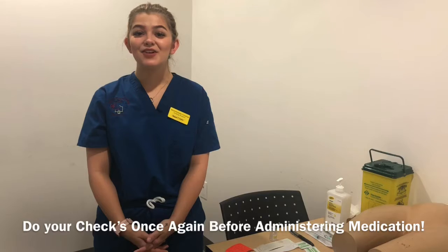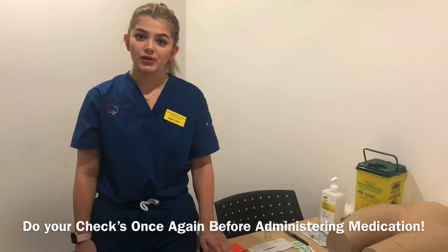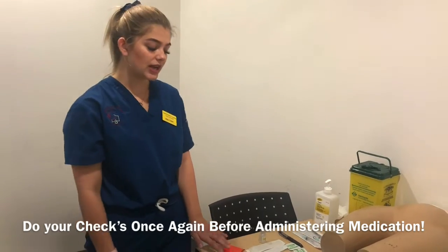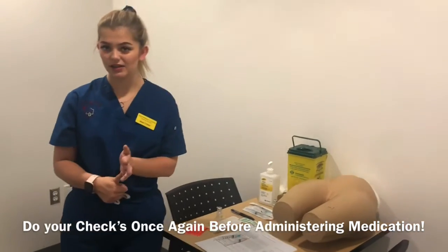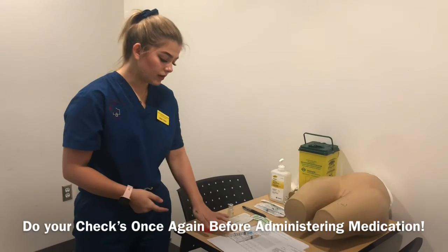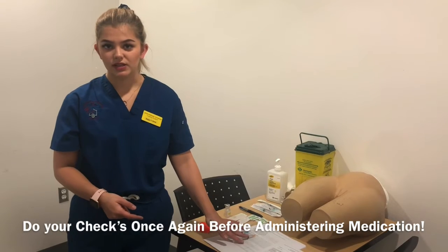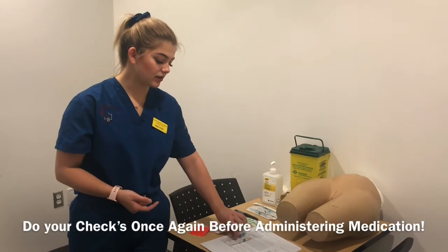Okay, so now that I have all my syringes filled up, I'm going to check my MAR once again before I go to the patient to administer the medication. So what you want to check again is that you have the correct medication. So you want heparin and Haldol. That's correct. You want to ensure that you're giving the right amount. So you want to give 1 milliliter of heparin. You want to give 0.5 milliliters of Haldol. You want to make sure that you're using the correct syringes.